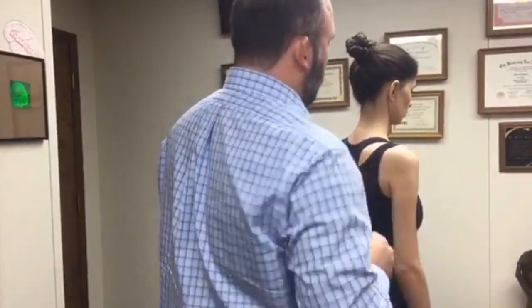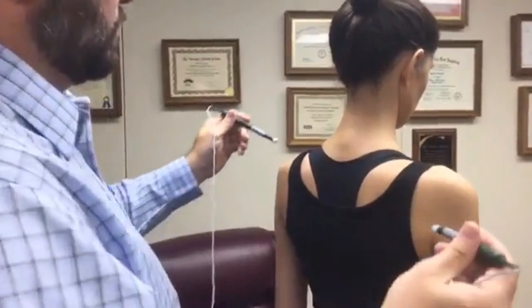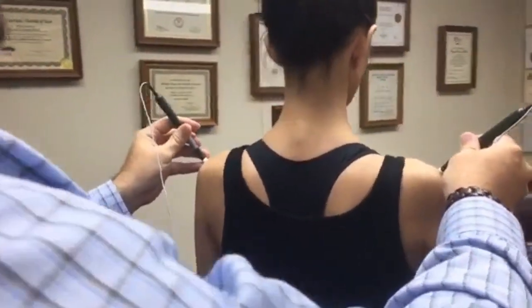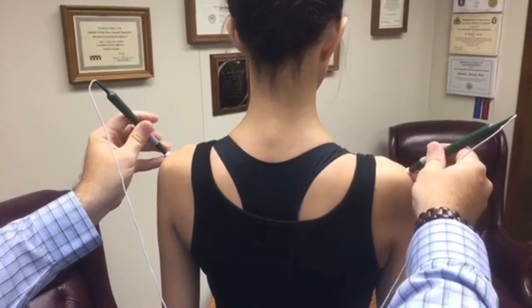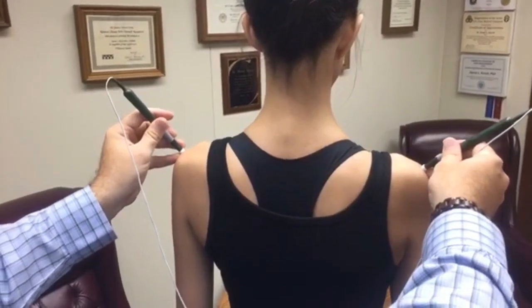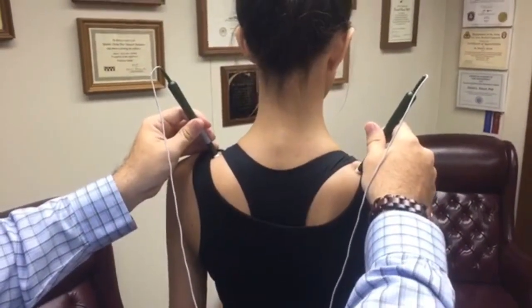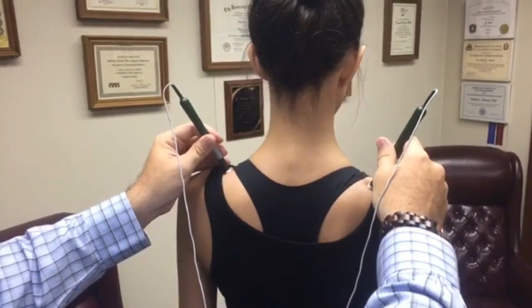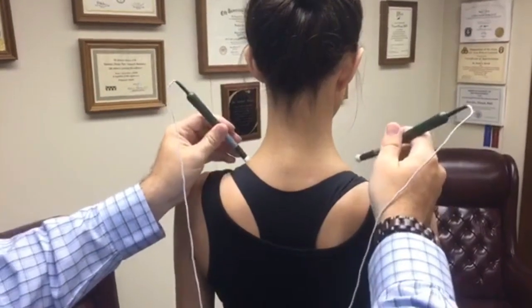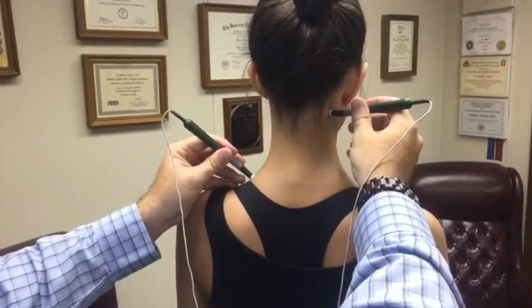It's a really quick and easy way to treat the shoulder. The other one we get asked a lot about is how to treat neck and cervical pain. We're going to show the same basic protocols, but when we treat neck pain we do it a little differently because we also treat across the shoulders. People have headaches, neck tension, and all that starts with the musculature. So we want to treat right across the acromion process and across the trapezius muscles — just ten seconds — and move in a little closer to get the traps involved.